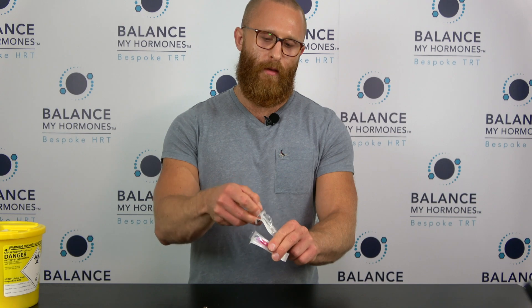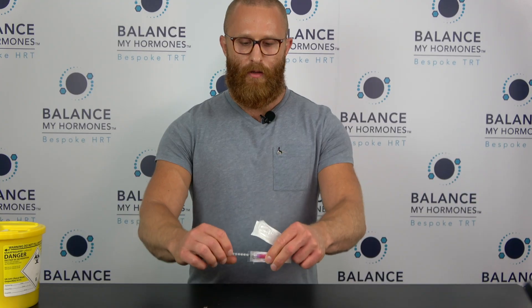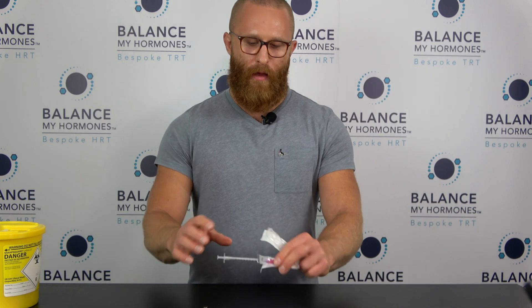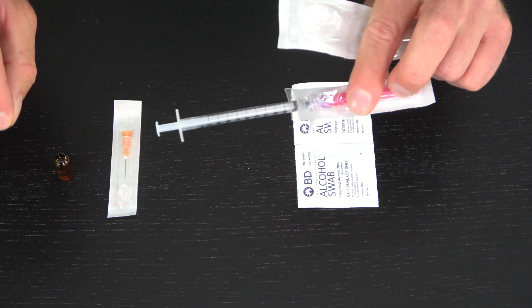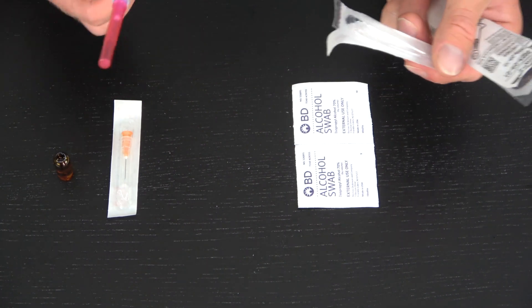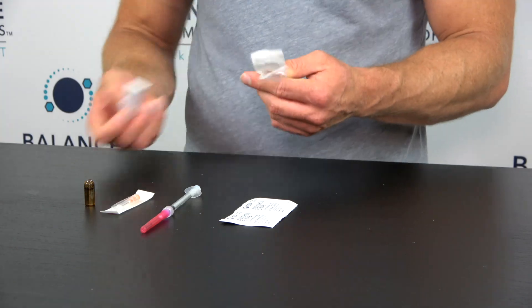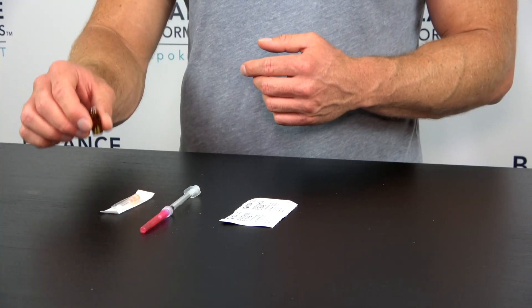We're going to draw back, take this syringe out, and attach the filter needle — it's a twist-on lock on this one. Some syringes just push on, but this one locks on. I usually leave it in the packaging but just so you can see it — there we are. I'll get rid of the packaging.